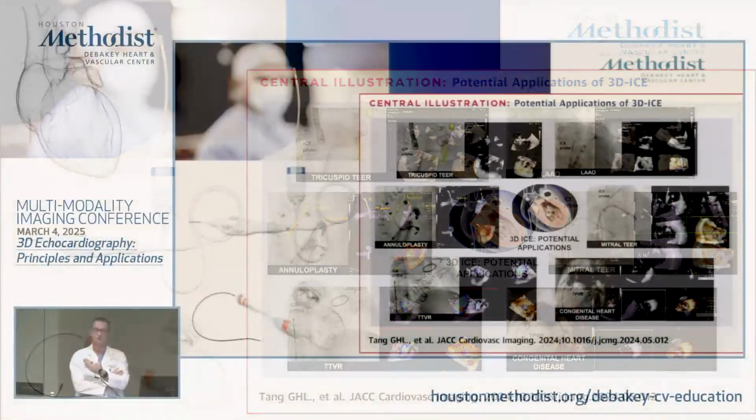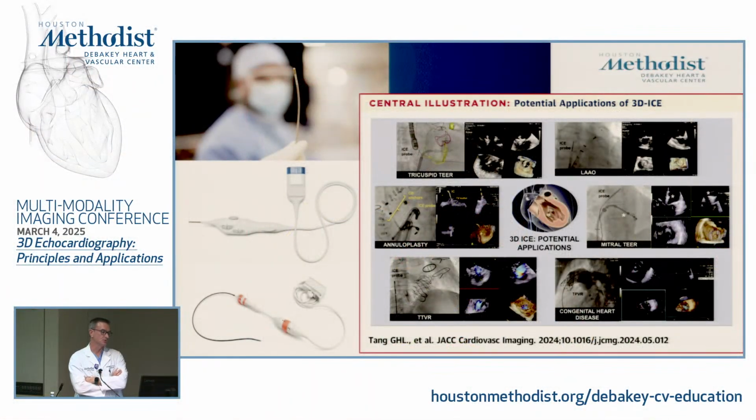So that's a fairly new sort of tool in our quiver. We're using it more and more. ICE, we used it yesterday for a complex tricuspid case. And this is the scenario when you have hardware, in the case yesterday, there was mitral apparatus, there was a left atrial, there was an atrial septal occluder, there was a pacer lead. Anything else, Issa? I think there was a lot going on there. A lot of other hardware, plus the clip we just put in.